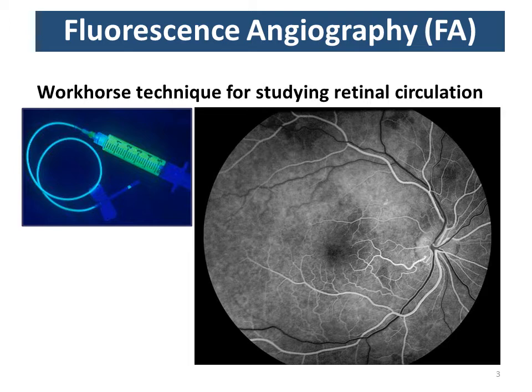And you can see here in this image, for example, the arteries are completely filled, like this artery here. Small vessels are filled, capillaries are filled, and veins are mostly at this point unfilled, but you see a little bit of filling from laminar flow of blood in retinal branching veins.